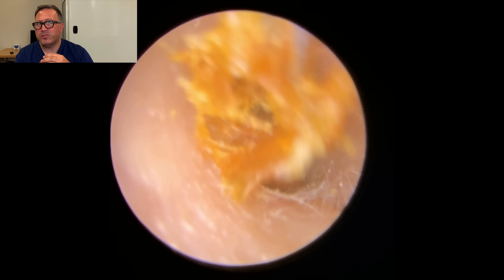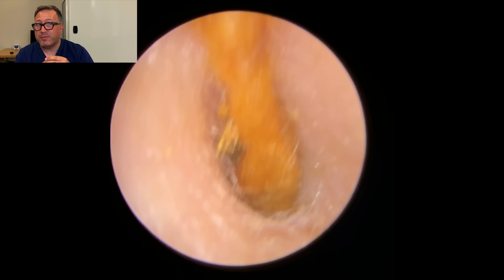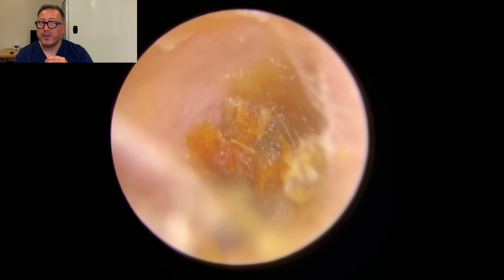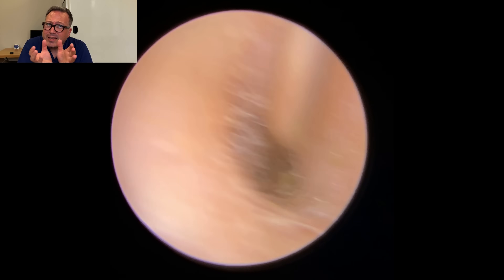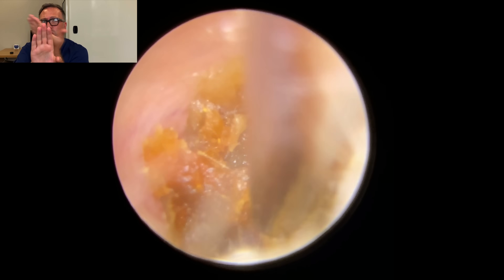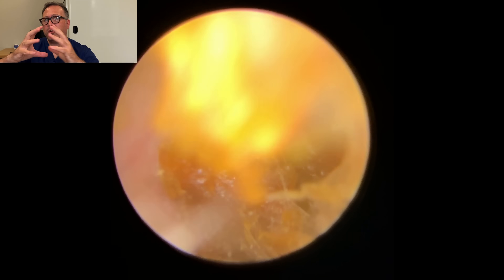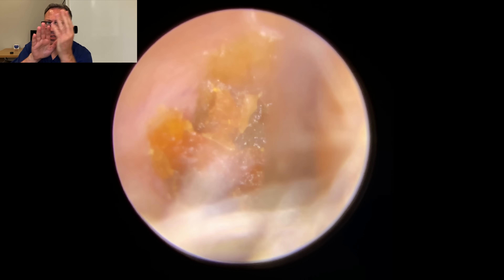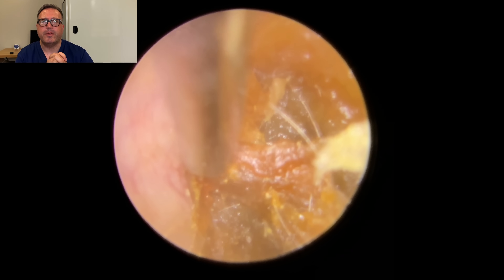Just wiggling, trying to move this down — you can see how tough this is. There we go — look at that coming down the canal. That's the first of your ribbons. You can see it was quite a long piece in such a tiny little ear canal. Really, really long pieces — you can see how they fold layer over one another all the way out. So when you pull it, it works like a concertina — it all unfolds into this long ribbon, and you'll see the little ripples in it where it's all concertinaed up in there.